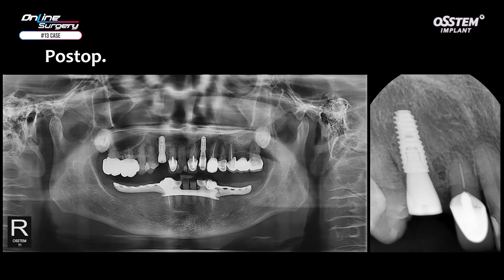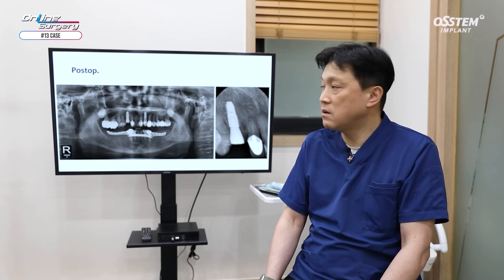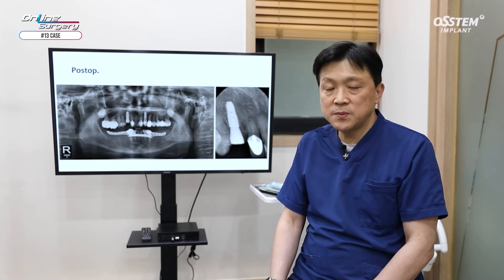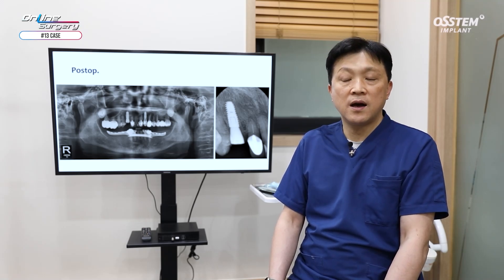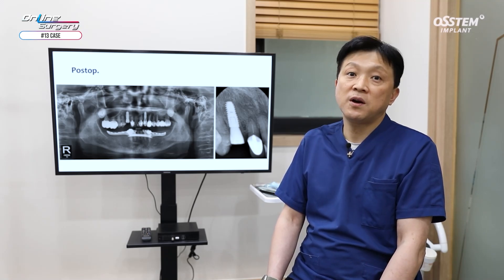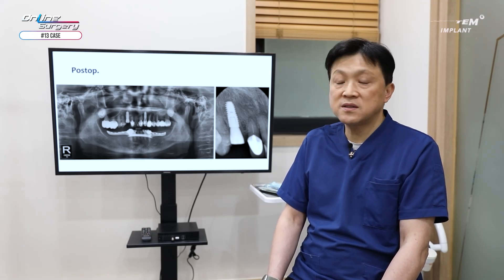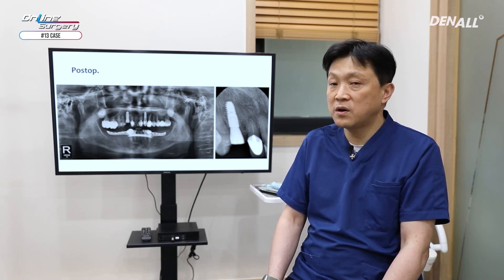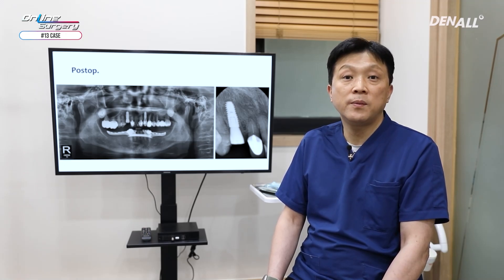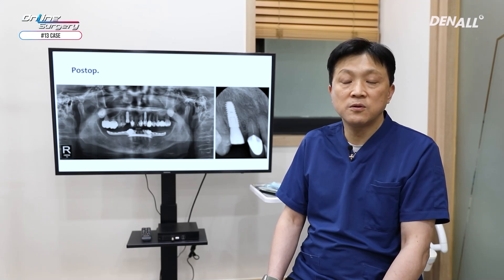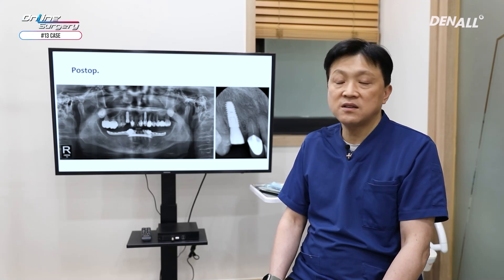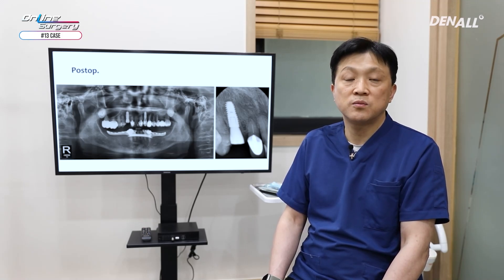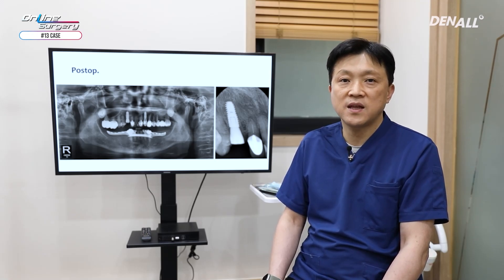On the standard image, the implant position looks appropriate. A KS3 4.0 x 10 mm implant was used. In the case of upper anterior, implant diameter choices are quite limited. With the KS3 4.0 x 10 mm deep connection implant, stability between implant and abutment increases, reducing the possibility of screw loosening. Even with a smaller diameter, it can withstand stronger occlusal forces or guidances. Deep connection implants are normally used in lower anterior or upper anterior areas where wider diameter implants cannot be placed.